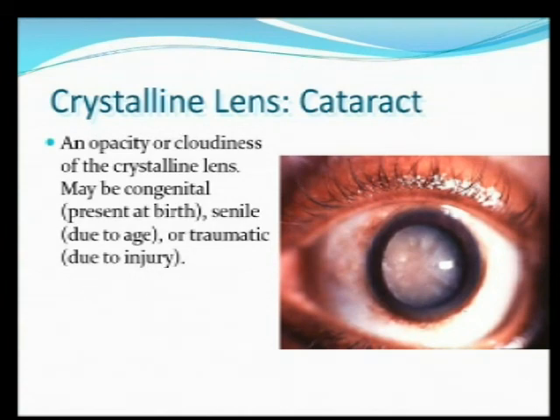And it's hard to get enough oxygen through the lens to keep the eye healthy. Plus, you've got to teach the parents how to deal with the lenses. So a whole pediatric aphakic lens fitting is a whole different specialty.